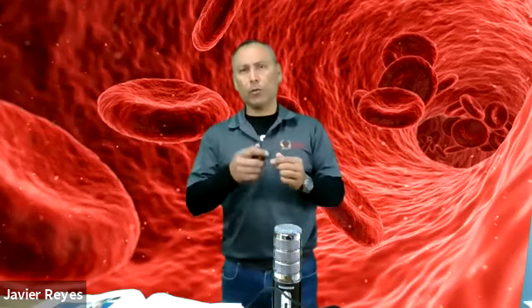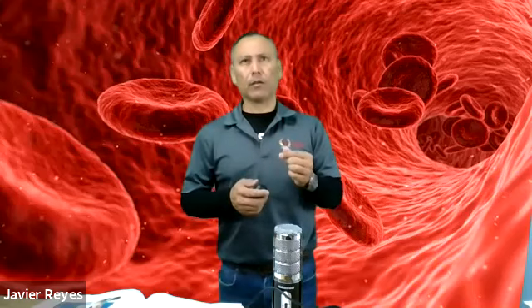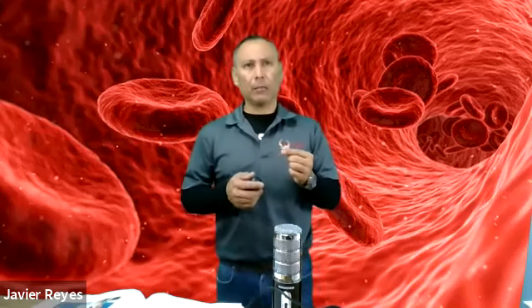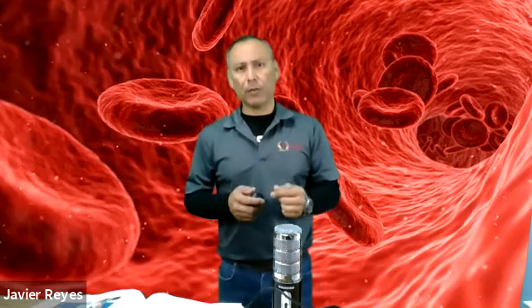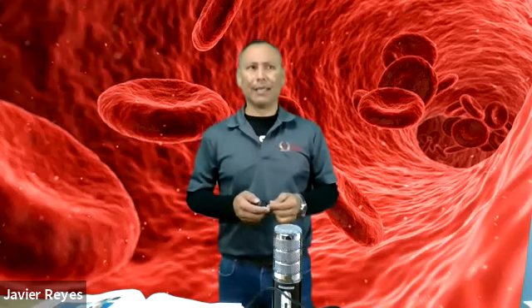These little tubes help you draw the blood into the micro collection container by an action called capillary action. It means the blood will automatically fill the space in the tube and drop into your micro collection tube. And we do this using the proper technique so that we don't collect excess intracellular fluid.